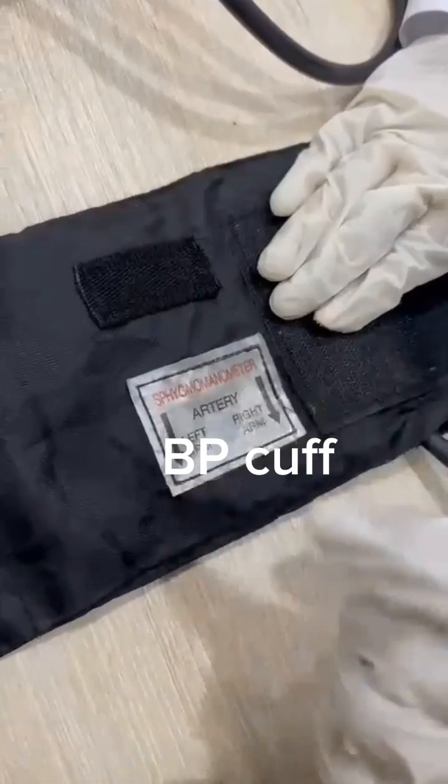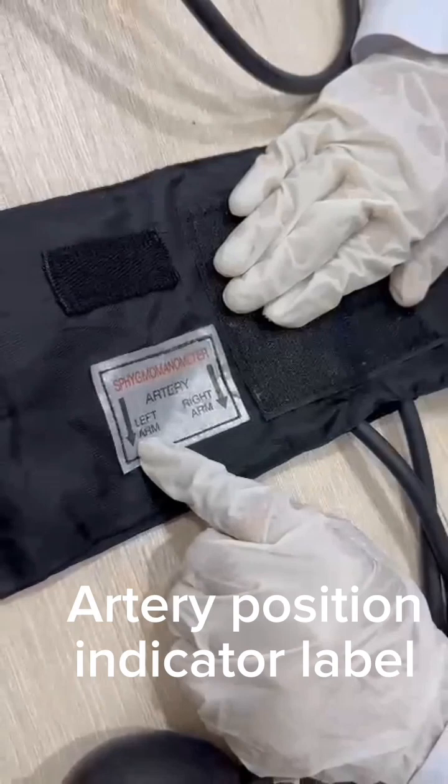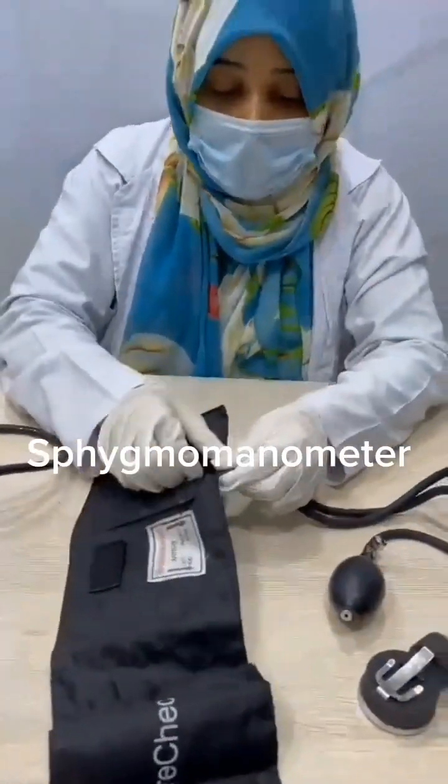BP cuff, ye different size ka hota hai. Position indicator labels for right arm and left arm. BP apparatus is also known as sphygmomanometer.